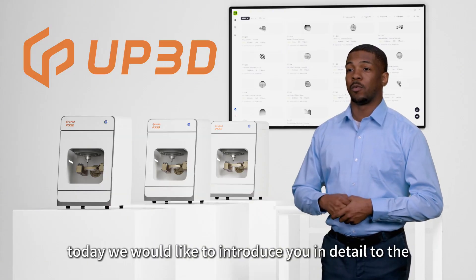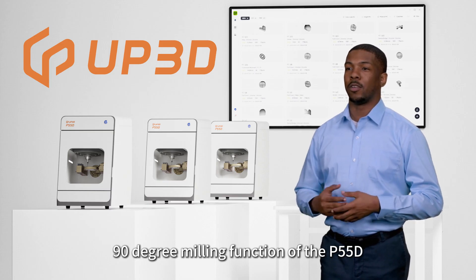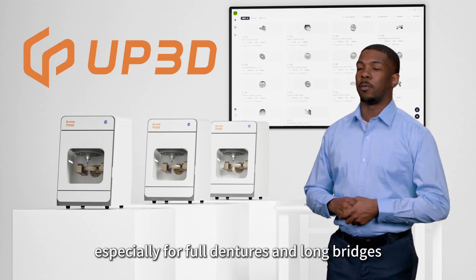Hello, everyone. Today, we would like to introduce you in detail to the 90-degree milling function of the P55D. This feature is particularly useful for aesthetic restorations, especially for full dentures and long bridges.